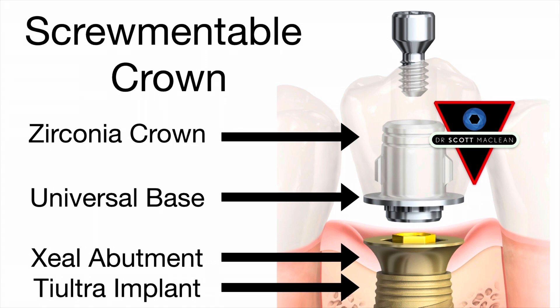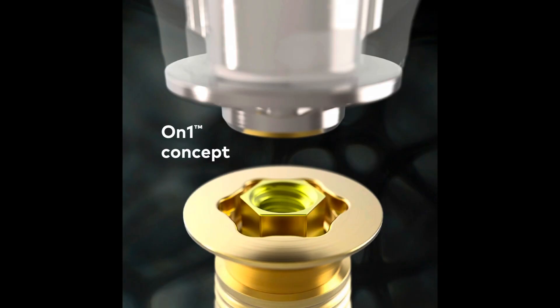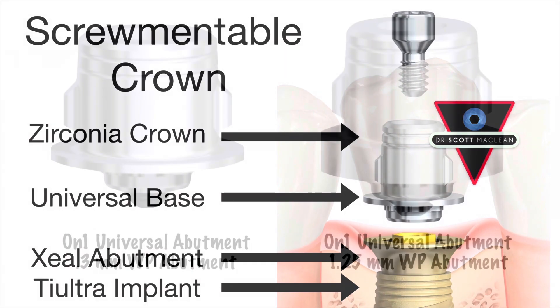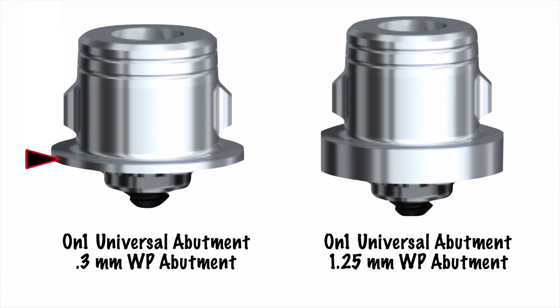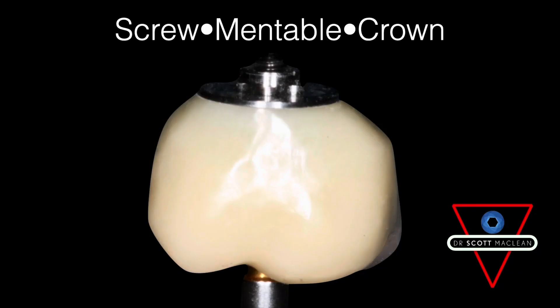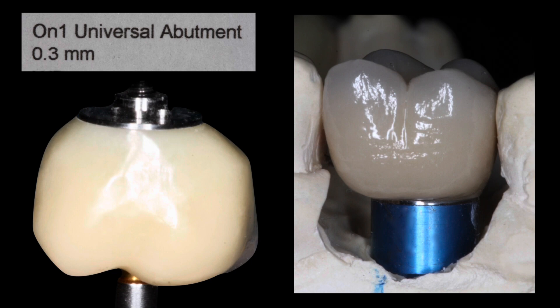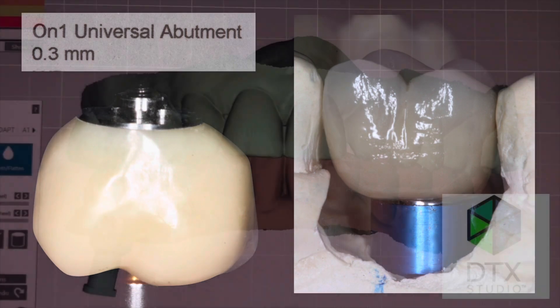On this case we're going to be using an on1 zeal abutment. It's an anodized gold color and this enables the tissues to be sealed at the time of surgery. Then we're going to come back and use a universal base and bond a zirconia crown to it. My favorite is the point three millimeter universal base, which is used to support the screw-mentable crown. Once you bond these two together they become one, and then it gets screwed in place — preventing any cement from getting into the area.